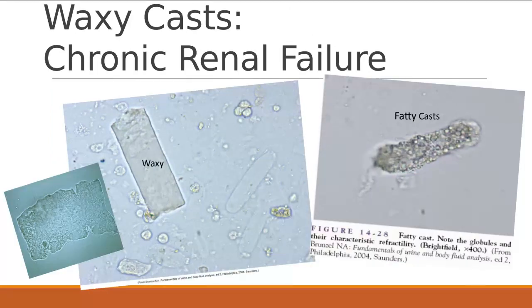Waxy casts, they look like blocked edges. So they kind of look like a piece of wax, I think. So they're very straight, blunt edges. This one over here has some little pieces torn out of it, but a lot of times this is what they look like.